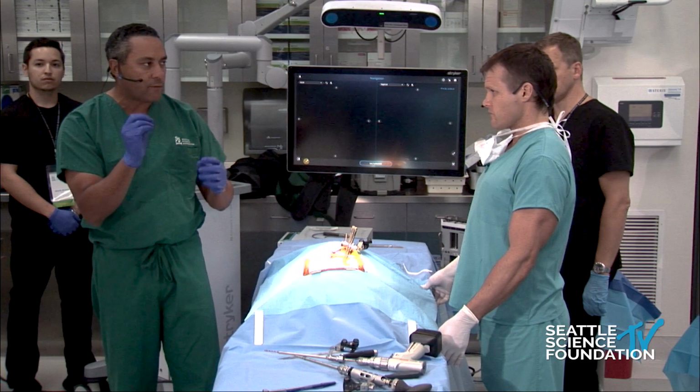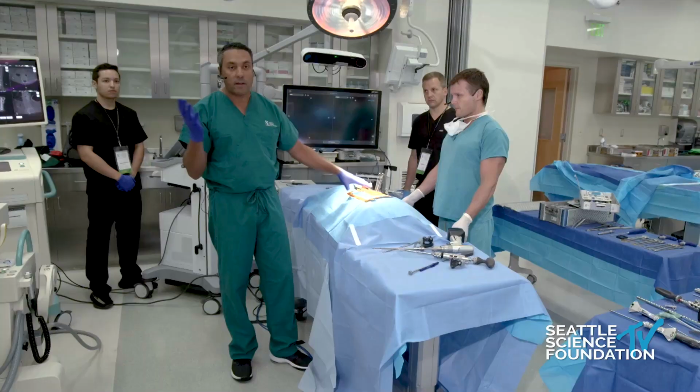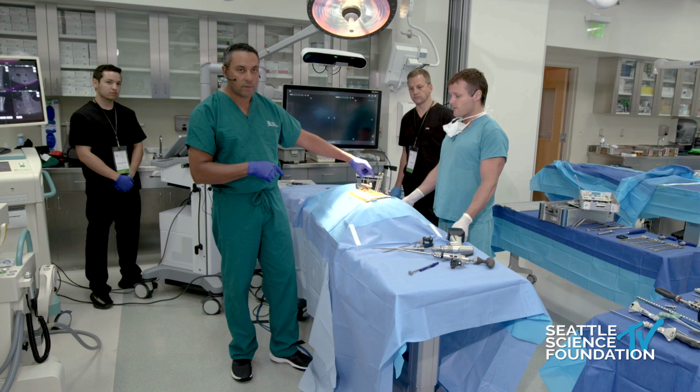So if it's a very large patient, then I actually wouldn't operate on them because I don't operate on people with a BMI over 32. But then I would also use this kind of system for that, a tracker that's affixed to bone.